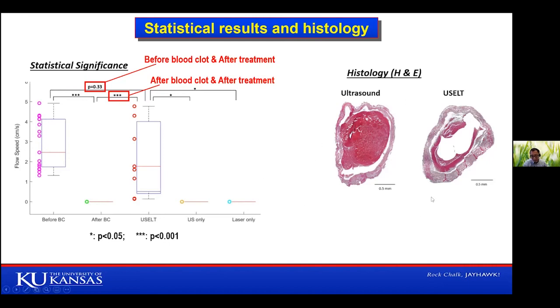Of course, we did this treatment by ourselves, and a technician did this one. Anyway, that's how well he can do. There are still some residues here. In this case, as we improve our technology, it should have the potential to completely remove those residues. So those are for the blood clot.